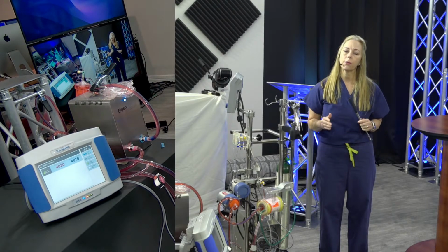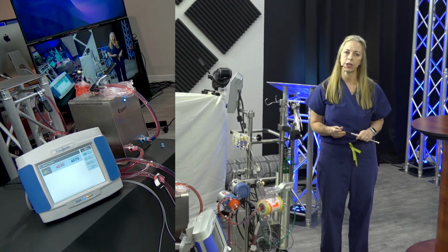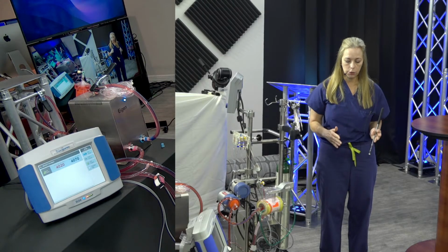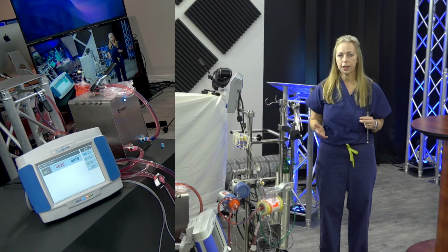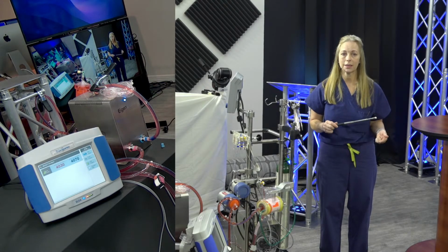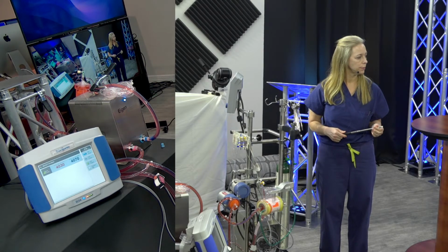And so that way you're able to use it as a tool to start planning when you want to change that oxygenator out, so that you're able to do it in a controlled scenario, so that you have less mistakes. Everyone wants to change an oxygenator when it's planned, not when it's urgent. Absolutely. Yeah. Very, very true.